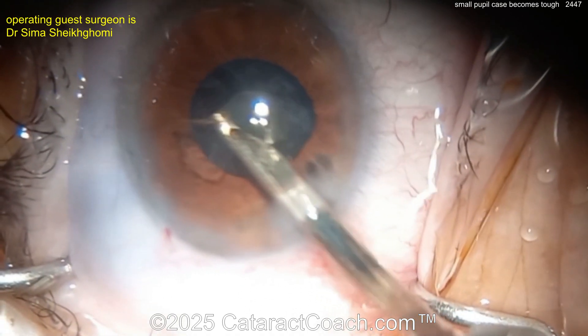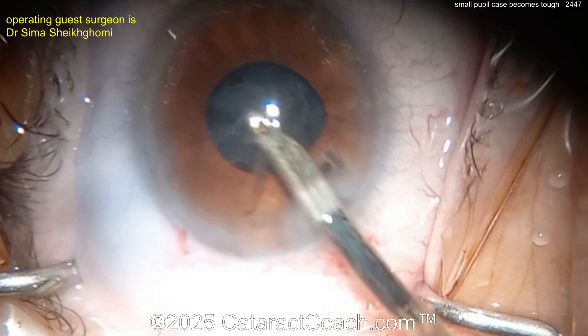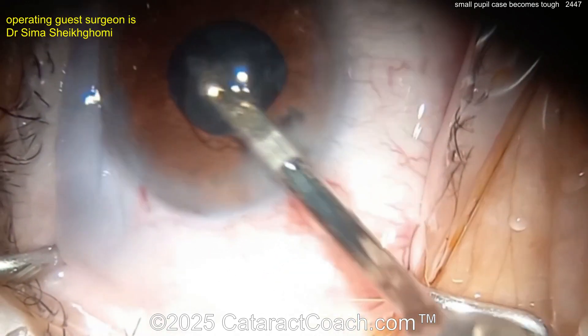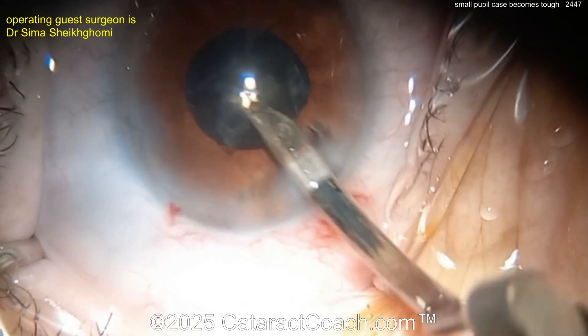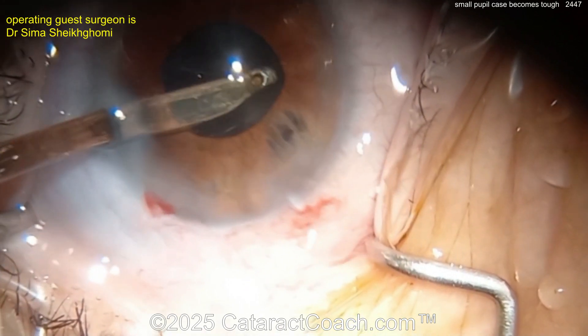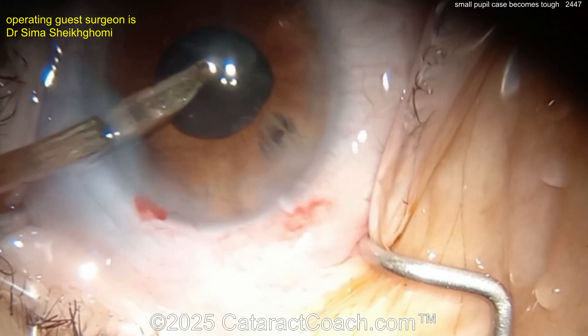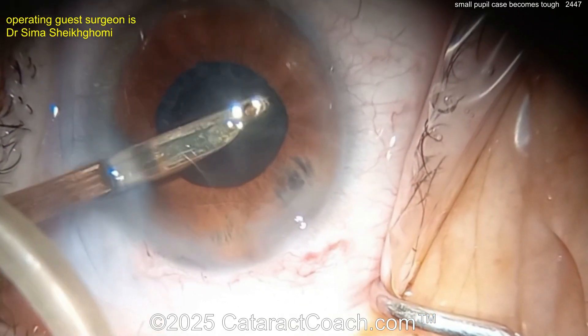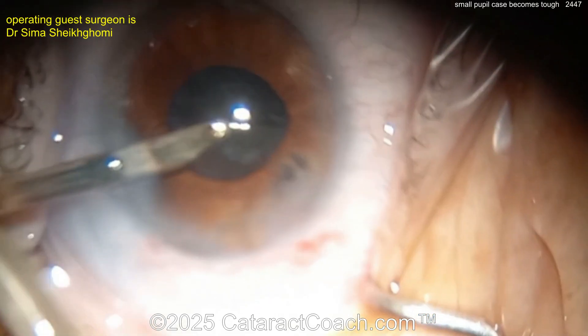What should you do here? You can finish up the case, put the lens in the bag, and the patient will have a nice outcome. If the patient is symptomatic from a ghost image or extra image through that iris defect, it's a relatively small defect that you can close or suture with a 10-0 polypropylene suture.